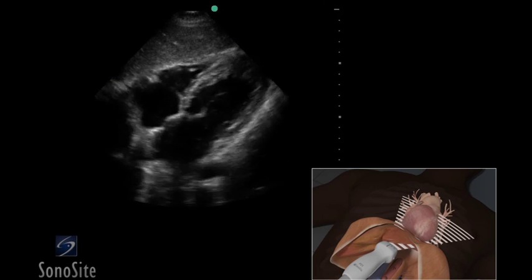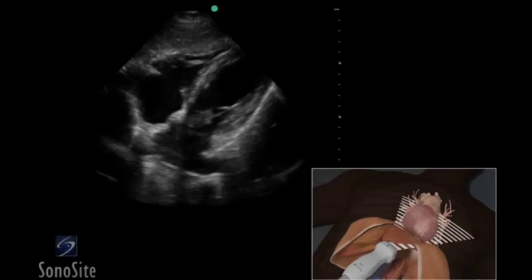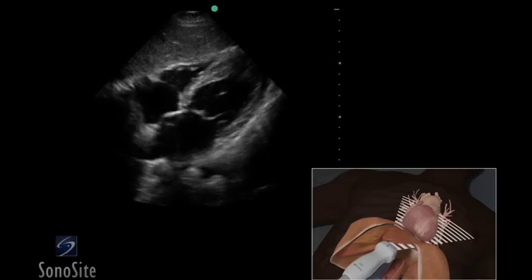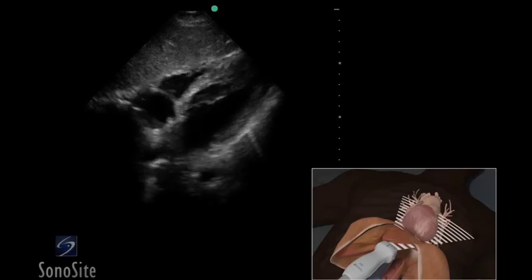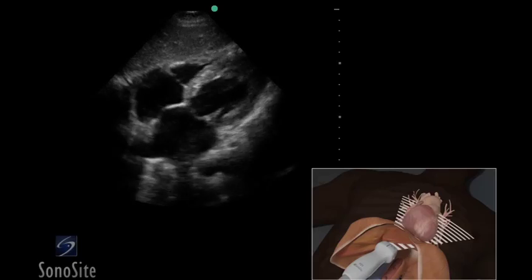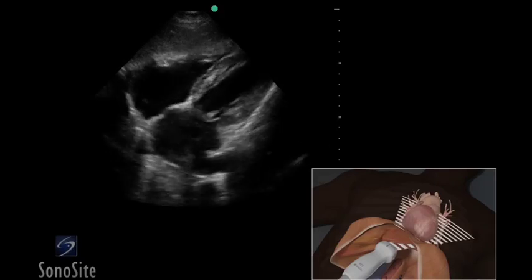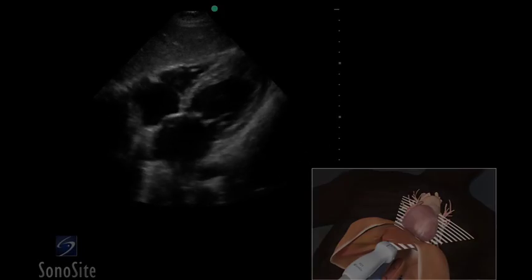Evaluate the function of all chambers. Compare the size of the right and left ventricular cavities. Note any wall motion abnormality and the presence or absence of pericardial effusion.